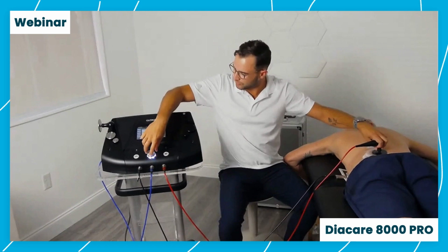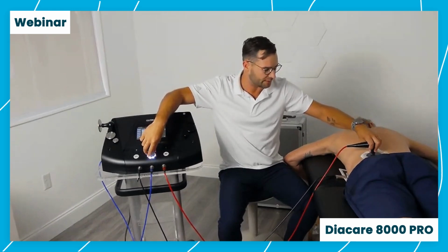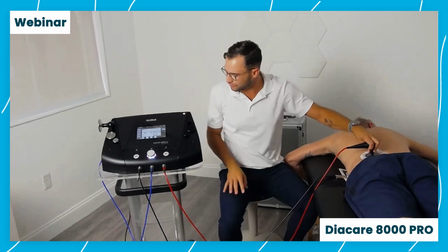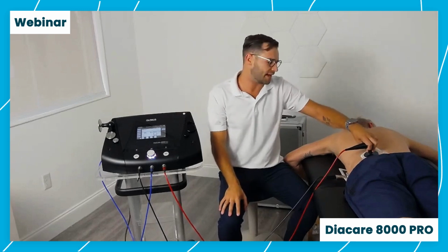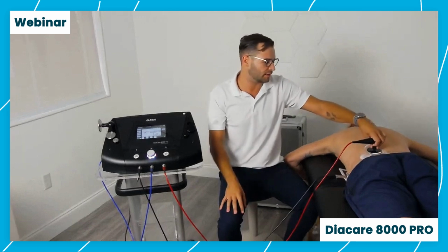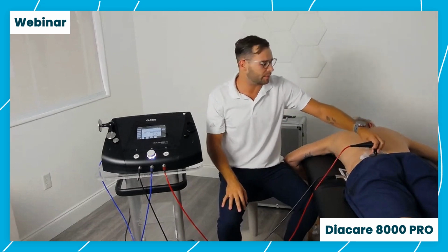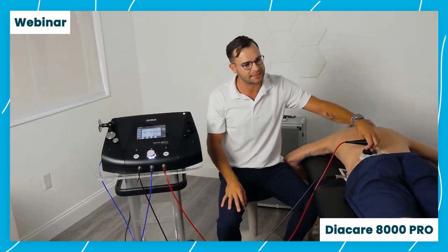We can also make sure, as we're going up here, it's going to generate heat within that tissue. And we can see in a colorful graphic on the screen the exact heat buildup, and it's showing relative to the color of the graphic how much heat is there, so the provider can be assured that they're not putting too much heat into the body.